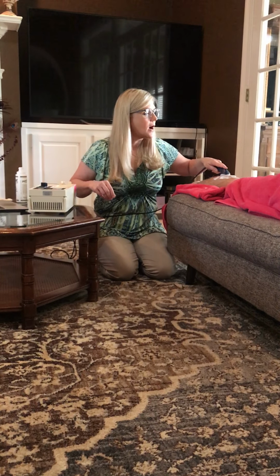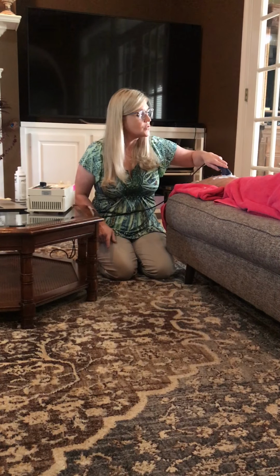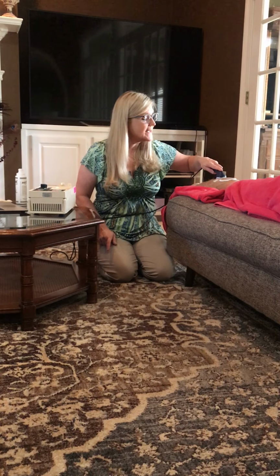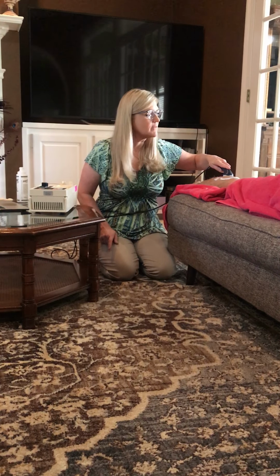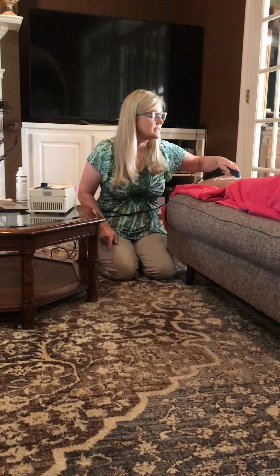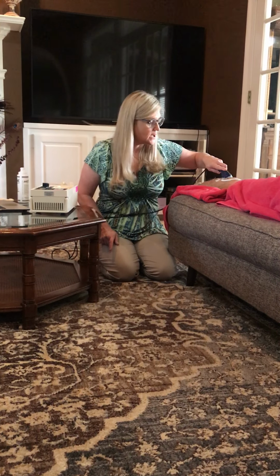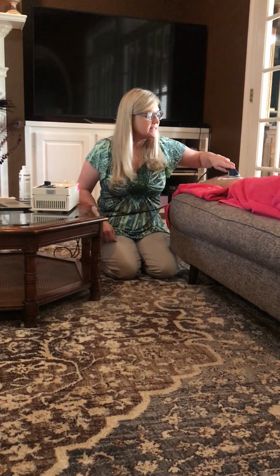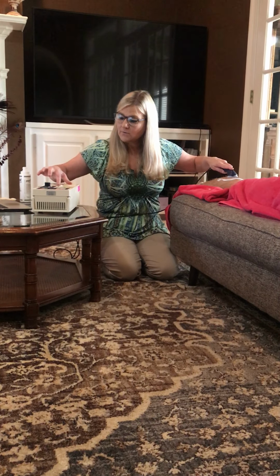Okay? All right. So that's 7.5 minutes, and we're going to continue this direct contact method. We're using good pressure so we can maintain contact. We're never coming off the surface on any part of our ultrasound sound head at all. It's going to make full contact completely this entire time as we go through the area of treatment. Okay? So when time runs out, then we're going to turn our intensity down to 0.